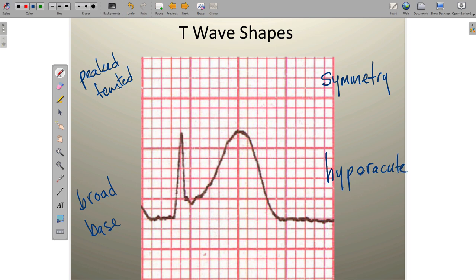When we talk about a peaked or tented appearance, a normal T wave is supposed to have a nice gradual upslope and a rapid return to baseline. It's not supposed to look like a teepee or to be peaked or tented, as is the case with this particular example. The next thing we want to look at is the base of the T wave. Look how massive and broad this T wave base is — it really shouldn't be that broad, it should be much more narrow. So a peaked or tented T wave and a broad base T wave always tell us about a problem.